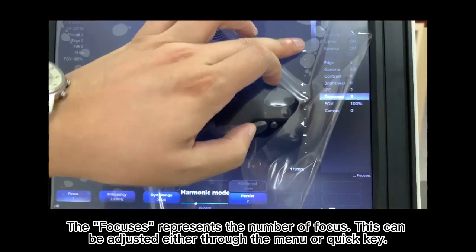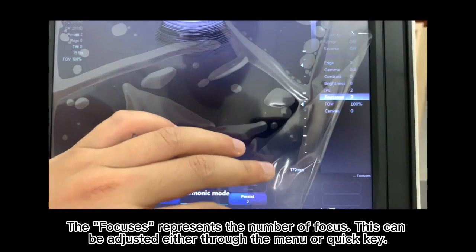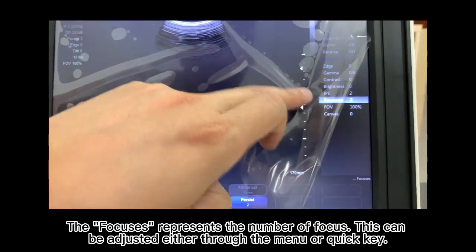The focus represents the number of focuses. This can be adjusted either through the menu or the quick key.